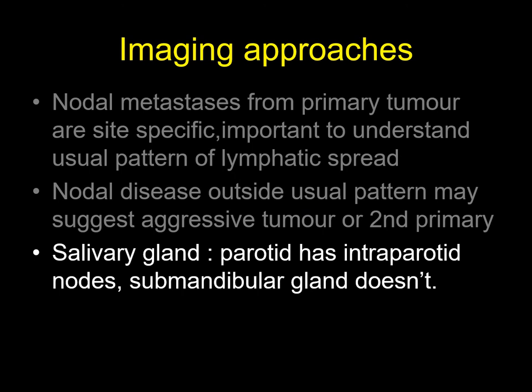Another very helpful tip relates to the salivary glands. When you scan level 2, you see just the tail end of the parotid gland, and the parotid gland has intraparotid lymph nodes — therefore it can have metastasis within those nodes or other diseases affecting lymph nodes. Remember, however, that the submandibular gland does not have any lymph nodes, due to the fact that it got encapsulated quite early on, and therefore it is very unlikely to have any nodal disease or metastasis within it.